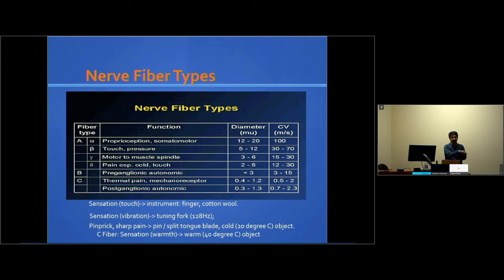There are other modalities which, unfortunately, are very time consuming, and there has not been any interest from Canadian institutions or from a governmental standpoint to fund those. They're mostly done in Europe, where they look at more somatosensory testing. But EMG is our main neurophysiological tool.